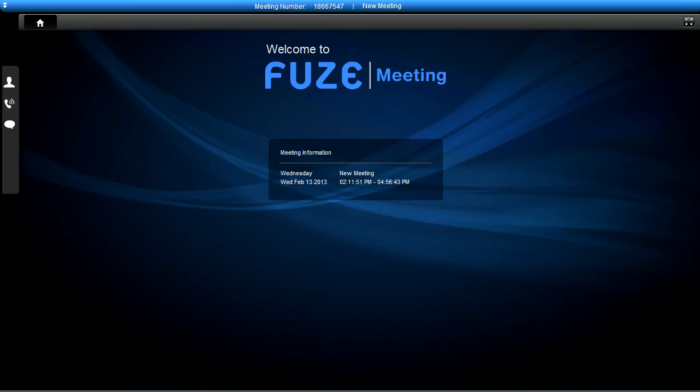So when's the Mac version coming out? What's the answer to that? The new viewer is largely tied at the moment to using it as Case Center, which is the server-side stuff. The current question mark is over the availability of a standalone version of the new viewer.